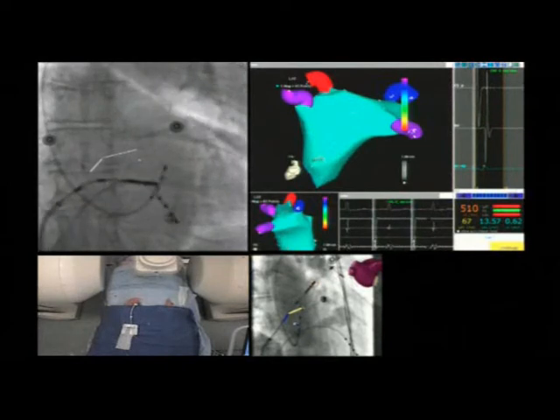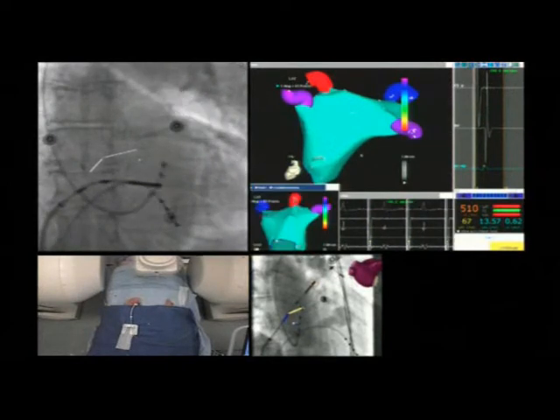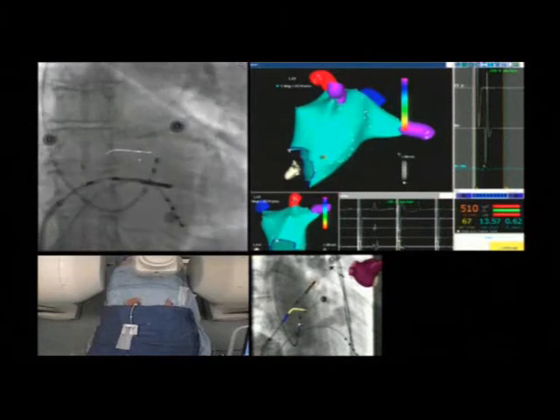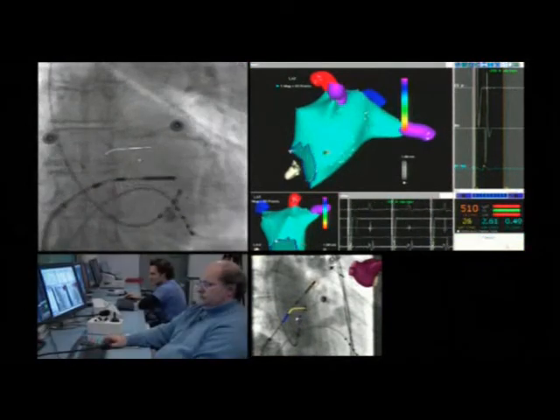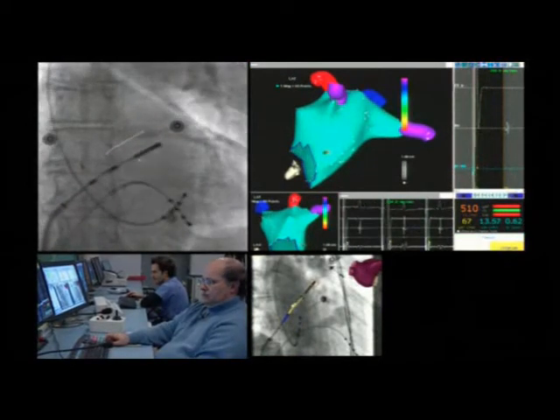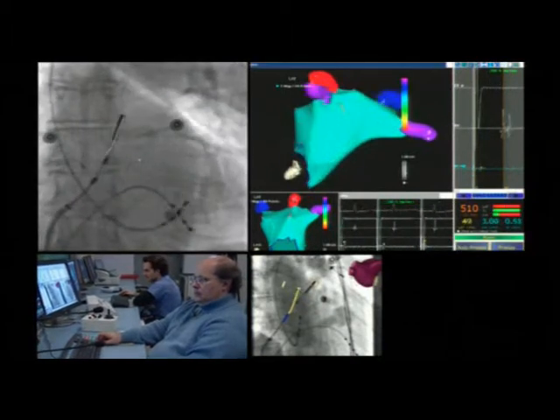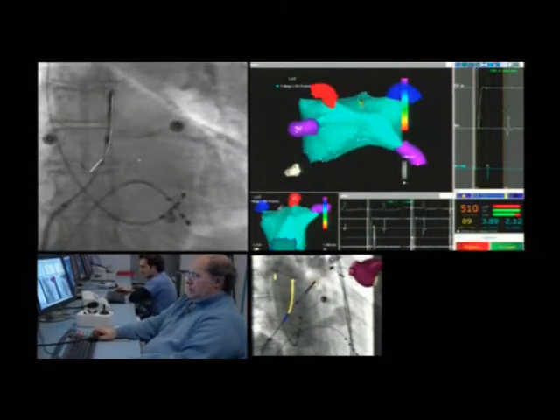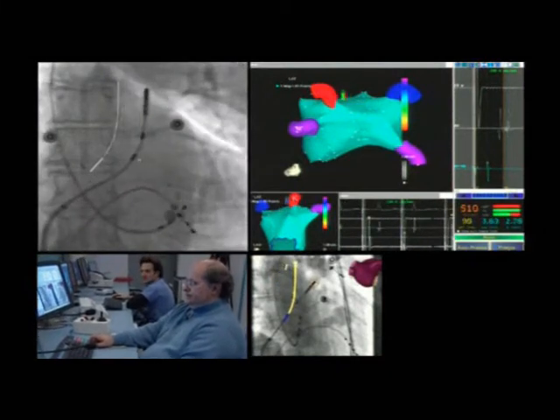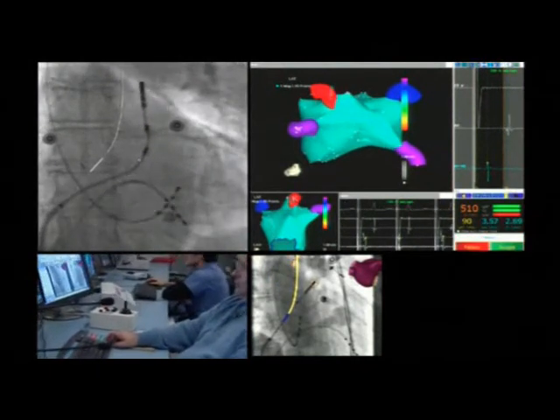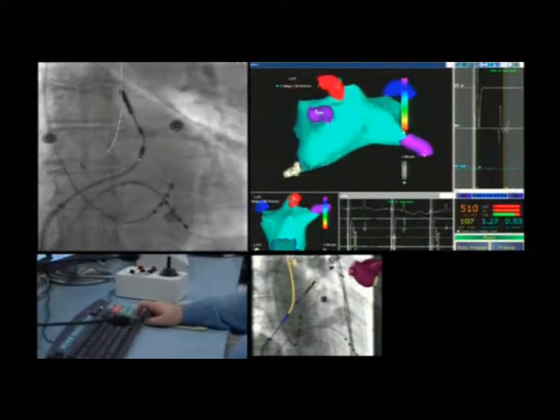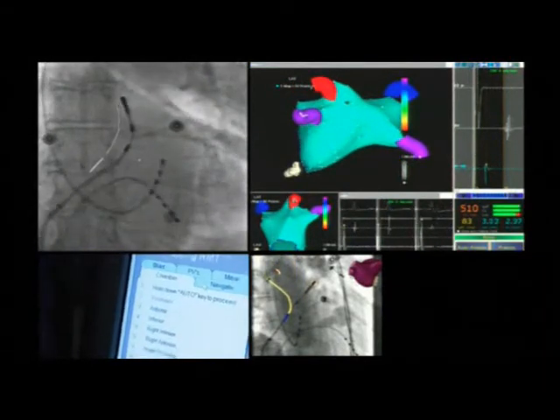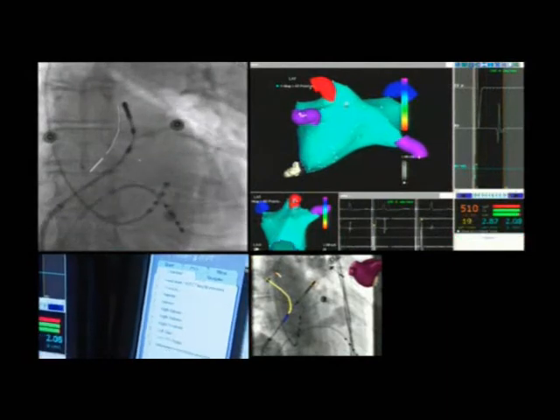With the stereo-taxis system you can perform a manual mapping as shown previously. Alternatively, a rapid auto mapping of the left atrium can be performed, but not of the pulmonary veins. The pulmonary veins can be mapped either manually or by using a preset selection button, but not by using the auto mapping.